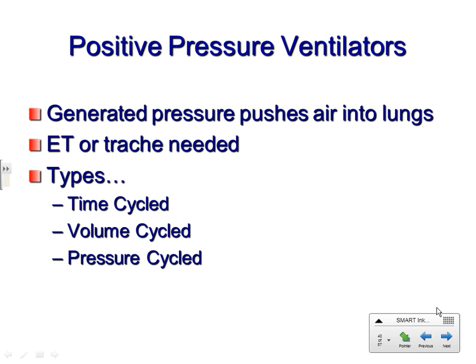And this is where a preset tidal volume, which is the volume of air that's going to be delivered with each breath, is programmed into the ventilator, and it will continue to push air into the lungs until that tidal volume is met. Now, if it's only volume cycled, then what kind of problem are you going to have? What if it puts too much air in and the lungs can't handle? It's going to keep pushing that air in until that preset tidal volume is delivered, and that can cause, again, overinflation or barotrauma, damage to the lungs.